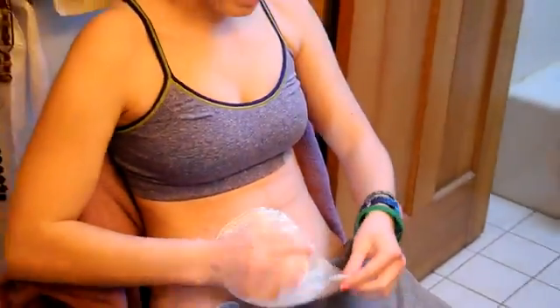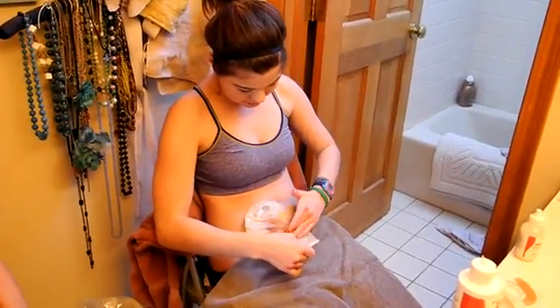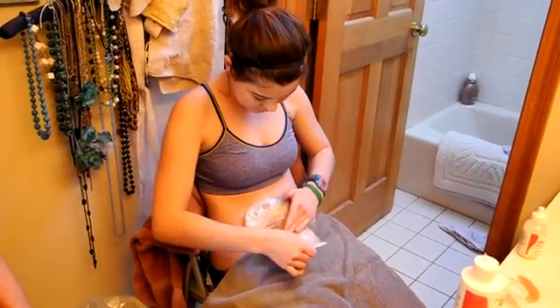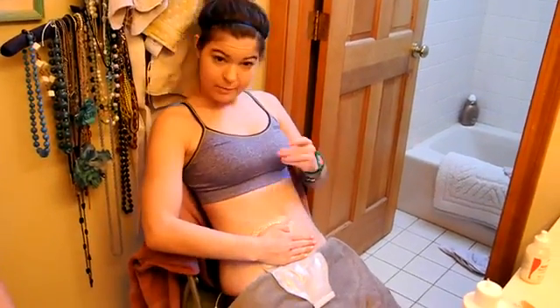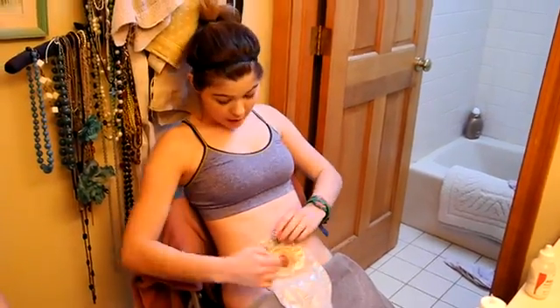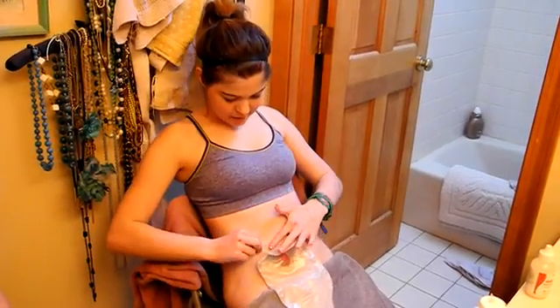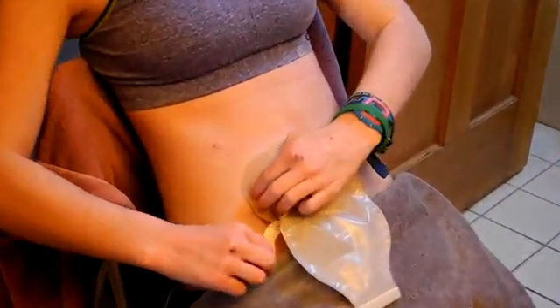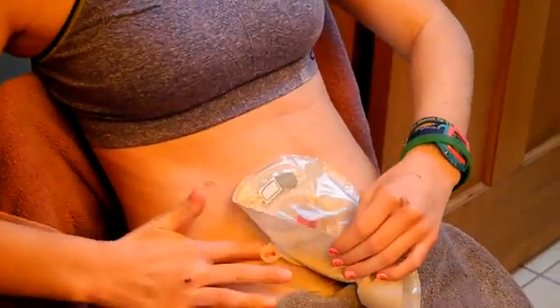And then you can work your way down around the stoma too, because that's usually where mine pancakes, and up around the sides. So just keep warming it. And while you're warming it, I make sure that I make my stomach as flat as it can be in order to simulate that I'm standing up. And you want to remove your waterproof barrier and just kind of pat it down. Remove the backing. Yeah, oh sorry, remove the backing to the waterproof barrier.